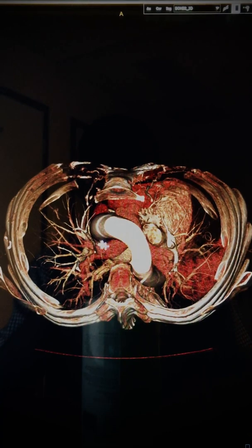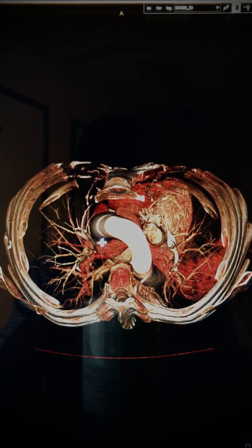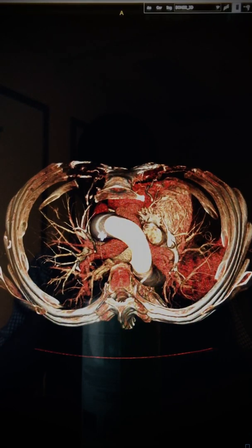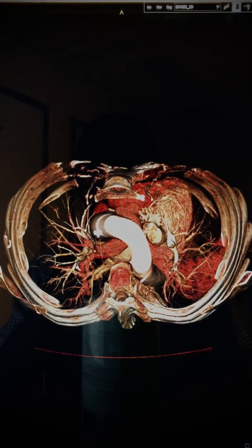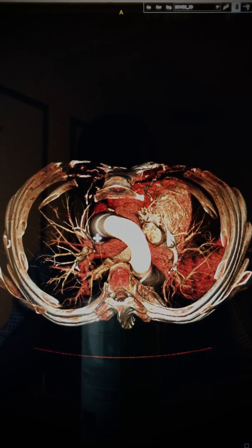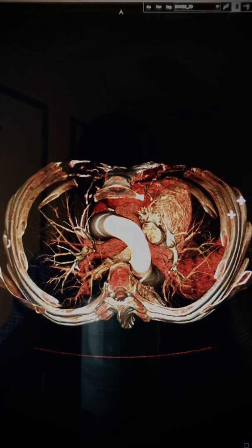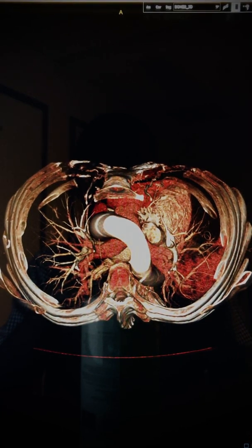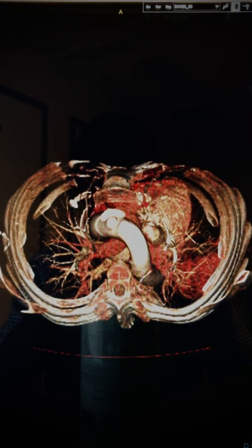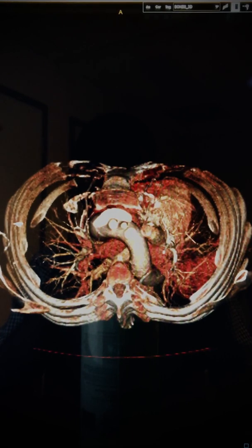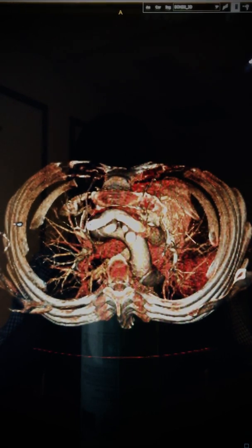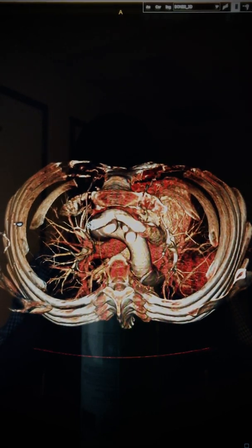In most people you have a vessel here, which is the superior vena cava. And in this patient, it's not present. Instead you have this vessel here. If you follow it more superiorly, you can see that it drains into the left brachiocephalic vein.